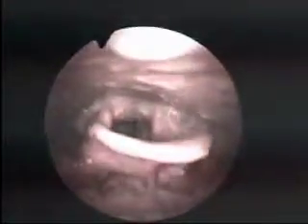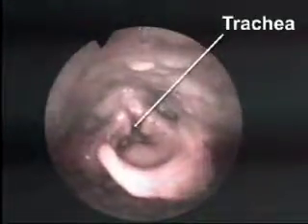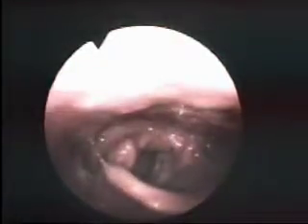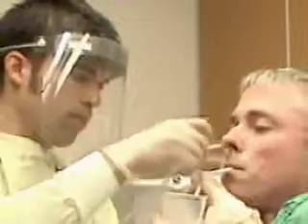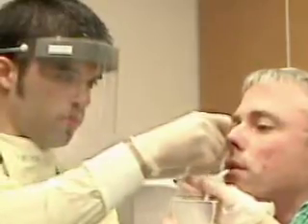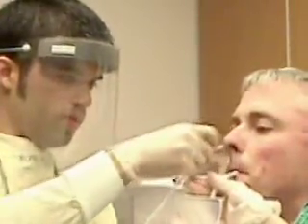As the tube reaches the level of the larynx, advancement is temporarily halted. The tube is then inserted as the patient swallows, and, once past the larynx, is rapidly advanced. Note that in this endoscopic view of the larynx, the trachea is frequently open and may be accidentally intubated with an NG tube. Note also that as the patient swallows, the laryngeal apparatus rises and the epiglottis covers the glottis, preventing tracheal entry. Once past the larynx, the tube may be inserted rapidly to the predetermined depth. Check the black markings on the tube to confirm proper depth of insertion.